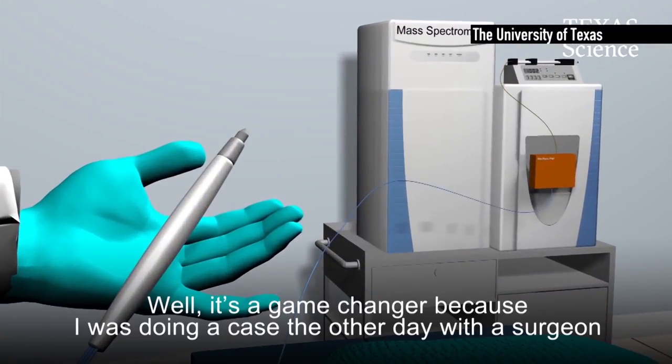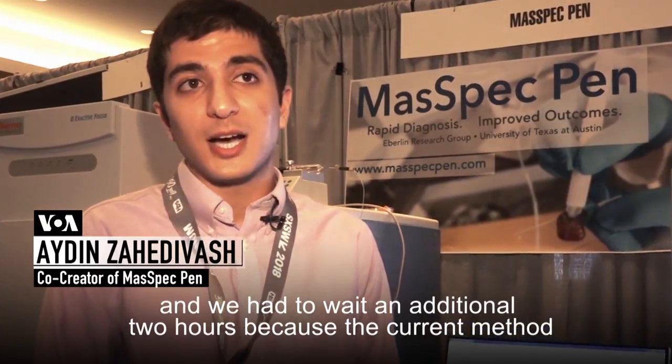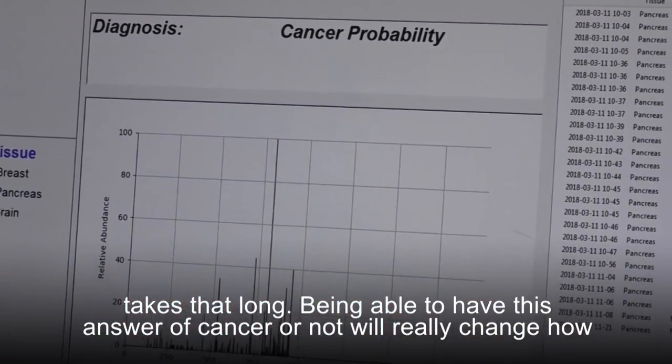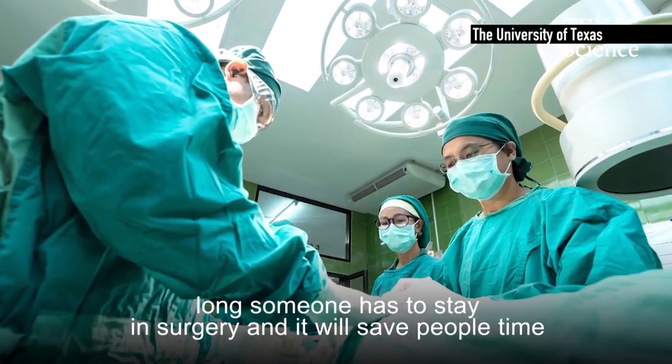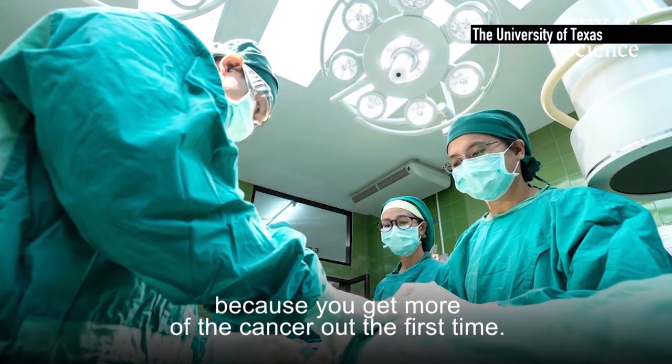It's a game changer because I was doing a case the other day with a surgeon and we had to wait an additional two hours because the current method takes that long. Being able to have this answer of cancer or not will really change how long someone has to stay in surgery, and it'll save people time because you get more of the cancer out the first time.